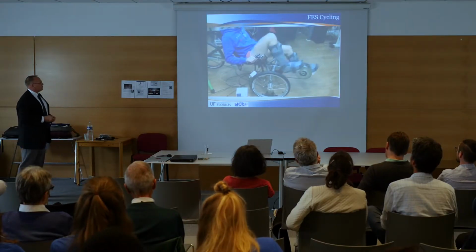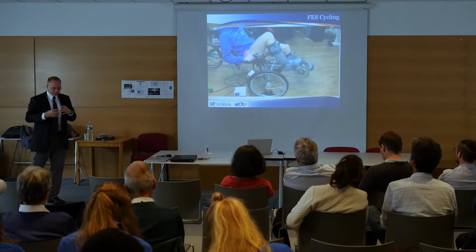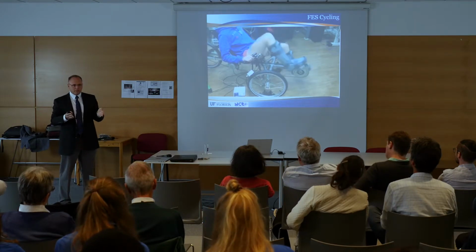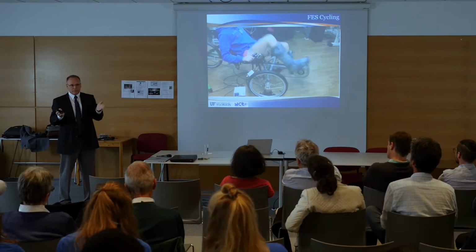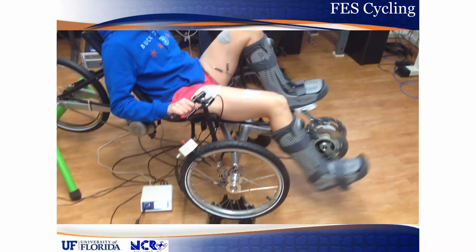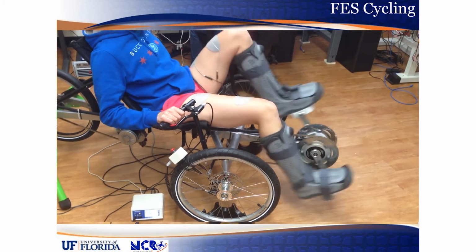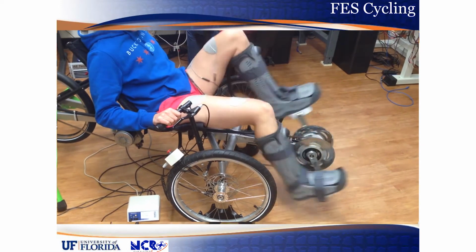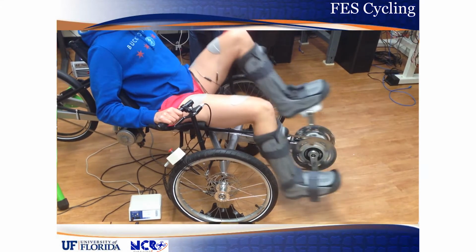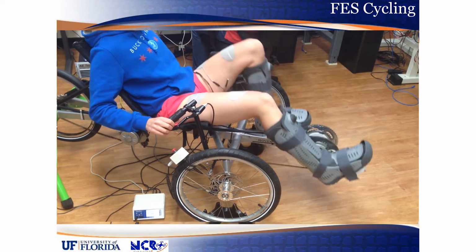So now moving on to cycling. The same kind of mathematical structures that we use to design controllers that could switch either spatially across the limb or to reduce fatigue, or spatially across a muscle group in order to maximize torque. Now we are switching across quadriceps, hamstrings, and glutes on left leg and right leg. So there's switching among the different muscle groups and switching between left leg and right leg in order to produce FES cycling.